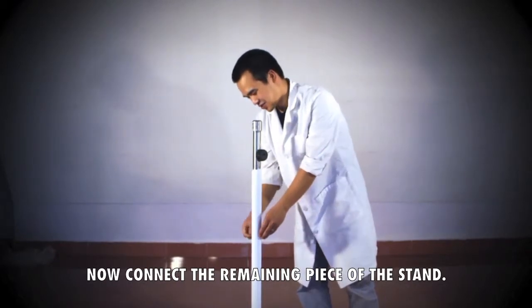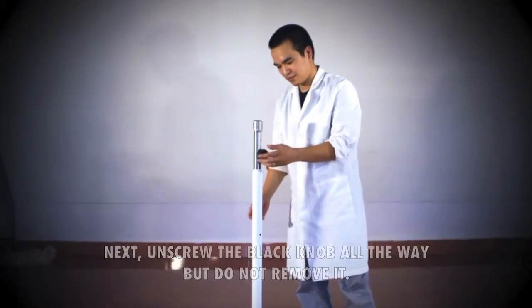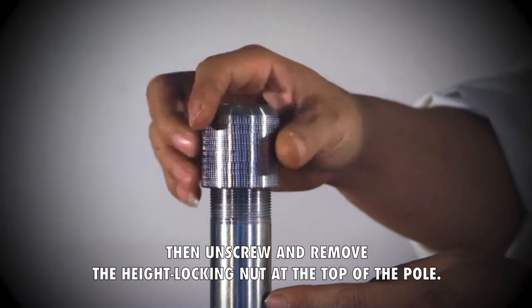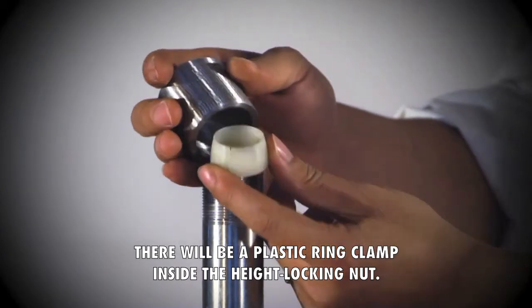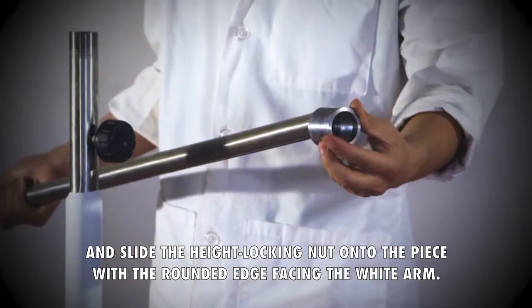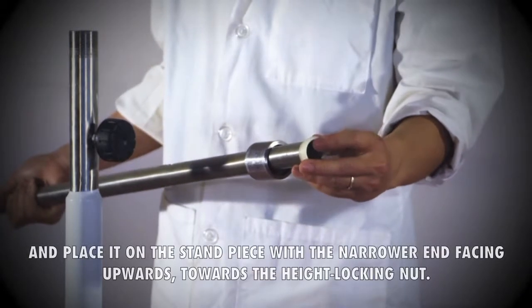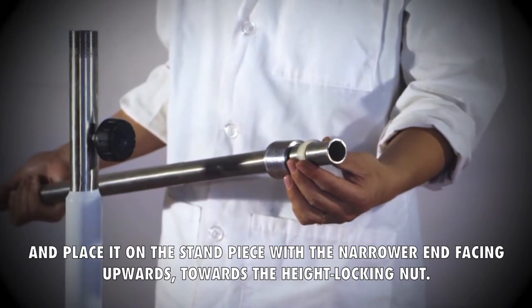Now connect the remaining piece of the stand. First, remove the screw that is in the middle of the stand. Next, unscrew the black knob all the way but do not remove it. Then unscrew and remove the height locking nut at the top of the pole. There will be a plastic ring clamp inside the height locking nut. Take the top stand piece and slide the height locking nut onto the piece with the rounded edge facing the white arm. Then take the plastic ring clamp and place it on the stand piece with the narrower end facing upwards towards the height locking nut.